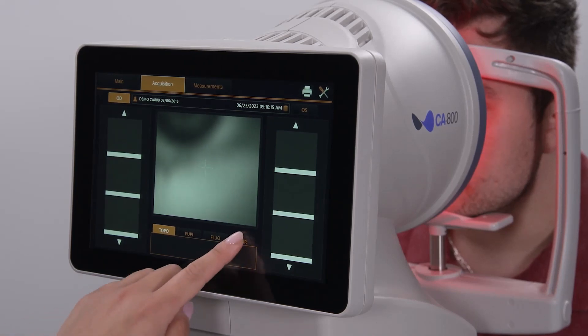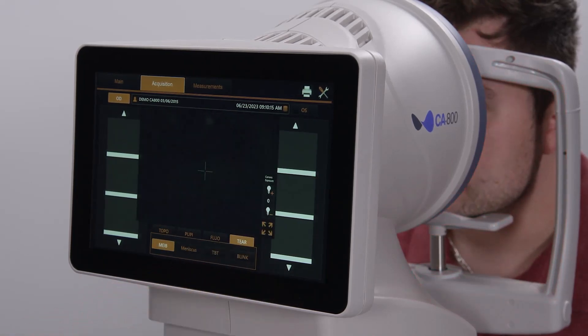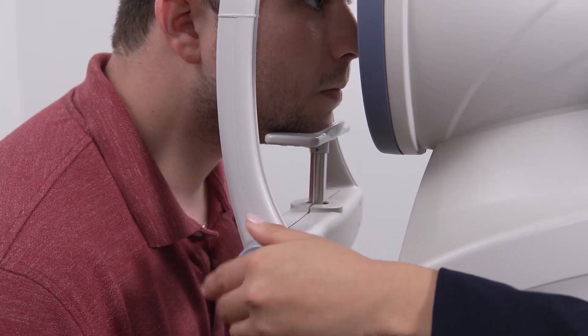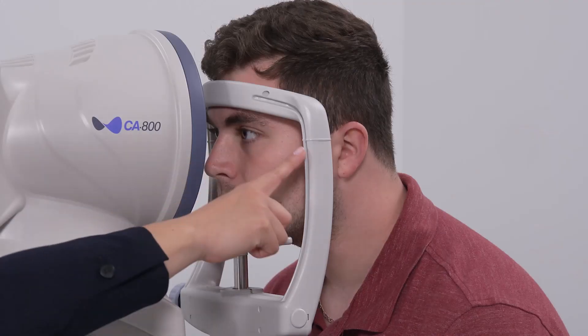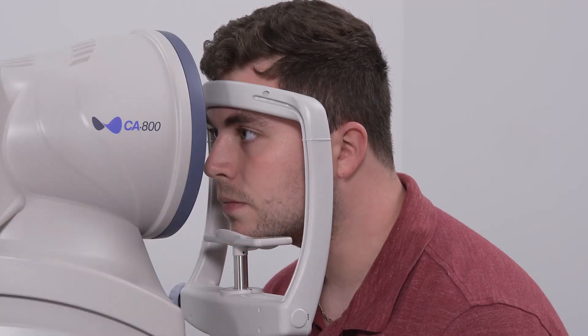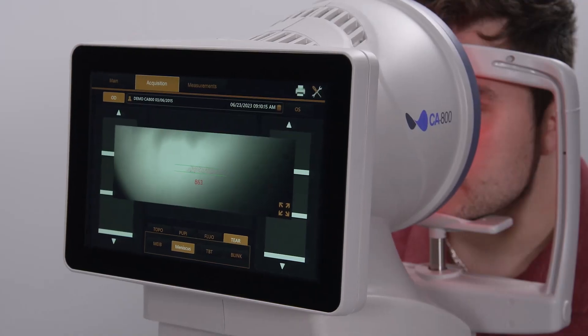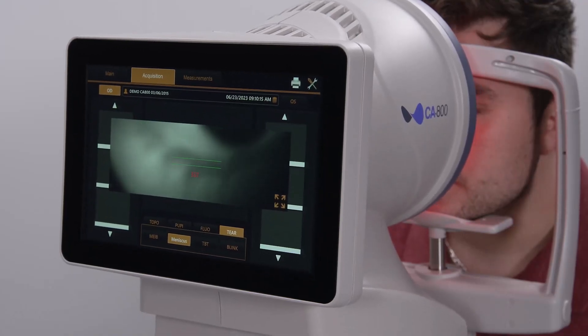Click on the tear tab at the bottom of the screen, followed by the meniscus option. Adjust the chin rest height so the lower eyelid of the eye is aligned with the canthus marker. Use the joystick to move the CA800 towards the patient until the lower lid margin comes clearly into focus.